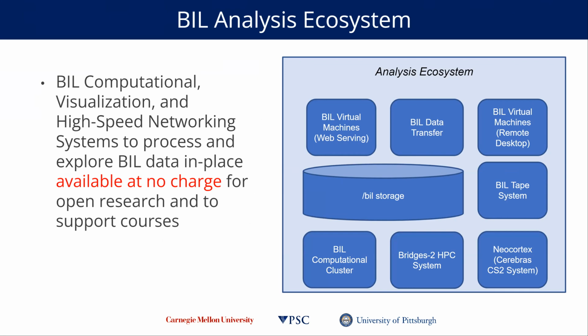BIL also provides a remote desktop environment and the capability to host unique web interfaces to the data. And we also support numerous software packages as well. All of these resources are made available to both data contributors and data users at no charge.